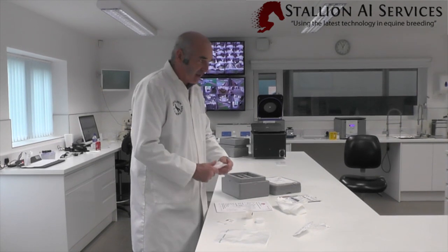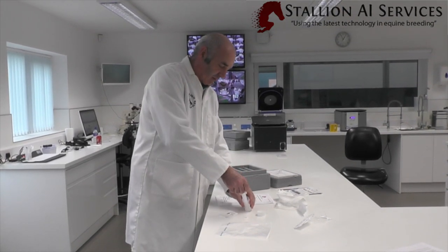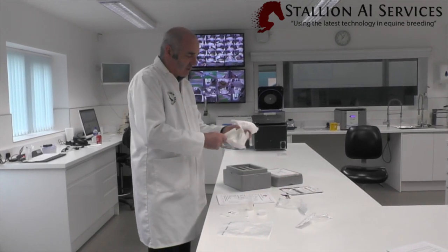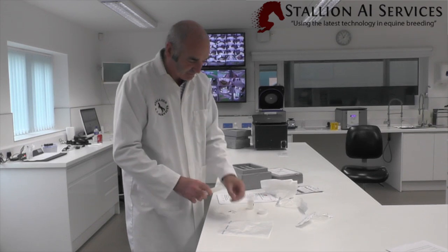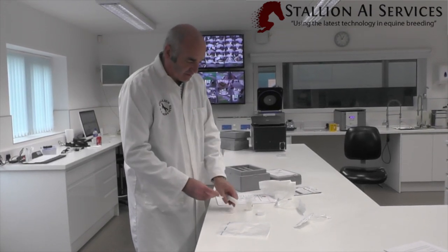So we put that one in. We get our other syringe, take the semen up, wipe that off, and stick the other label on.